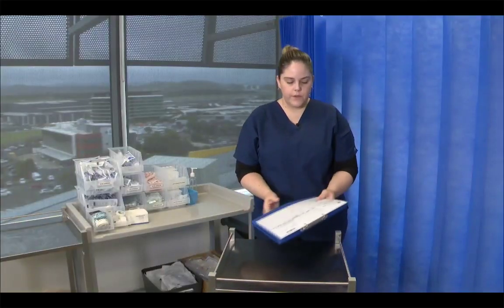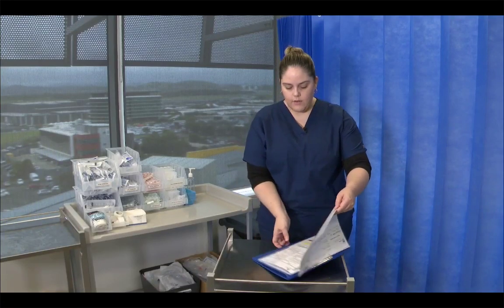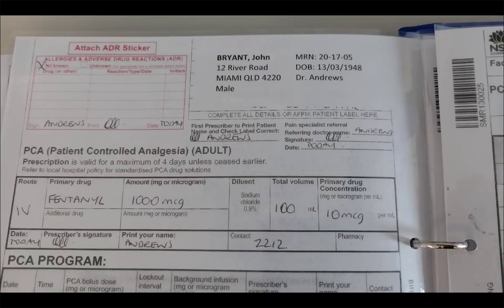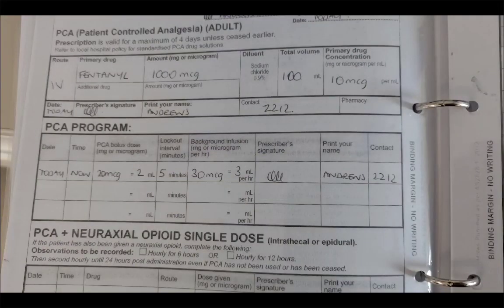legal order. So first I'm going to look at the IV fluid order, which is for sodium chloride 1000 mils, which I'm going to gather from my fluid room. And I have an order for a PCA which states that we're going to be using fentanyl 1000 micrograms using a diluent of sodium chloride 0.9% to a total of 100 mils. So that means that I have to remove the volume that I intend on using in the bag. And that's going to end up giving me a concentration of 10 micrograms per mil. So IV fentanyl 1000 mics.